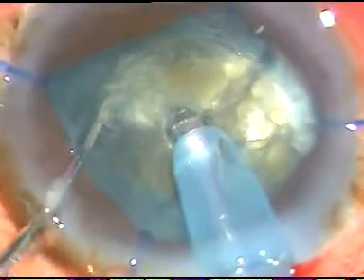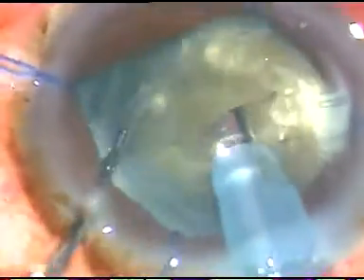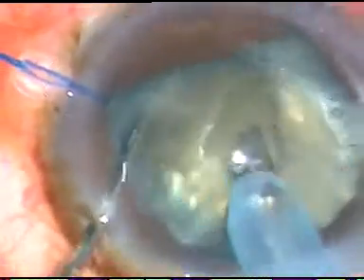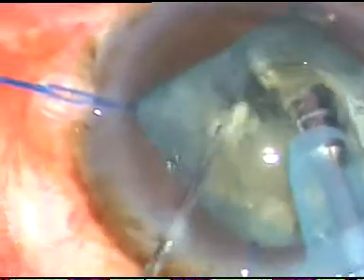Rotated the nucleus and chopping at another point. Rotate it, hold the nucleus, and the crack of the first chop is separated so that the nucleus divides into two. Now I chop again and this hemi-nucleus is being divided into three parts. This one small part is emulsified and taken out. This is the larger part of this hemi-nucleus.